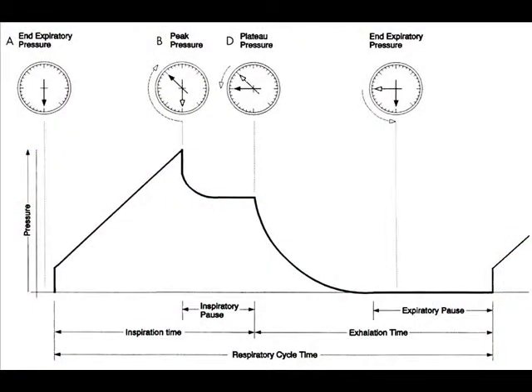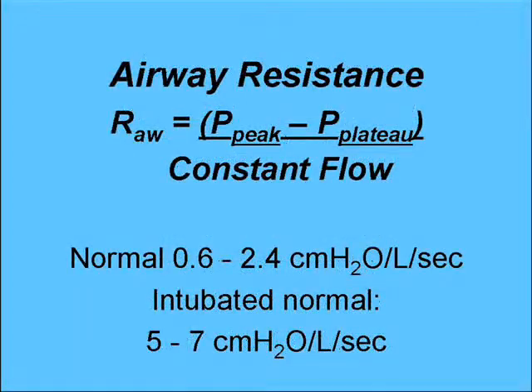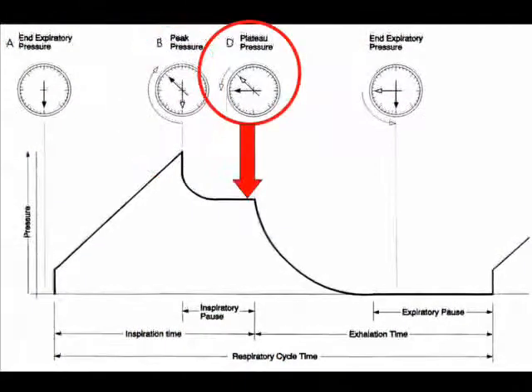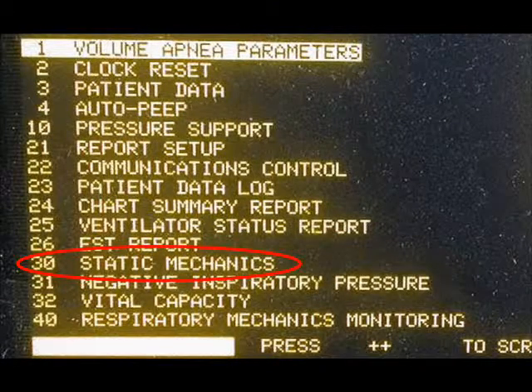Prior to the challenging of the competency-based objective, the student is encouraged to review the respiratory anatomy and physiology and mechanical ventilation theory as it relates to pressure scalars, compliance, resistance, elastic and non-elastic resistance as a theory component of the competency-based objective. It is also strongly recommended to familiarize yourself with the capabilities and limitations of the particular ventilator on which the competency-based objective will be challenged.